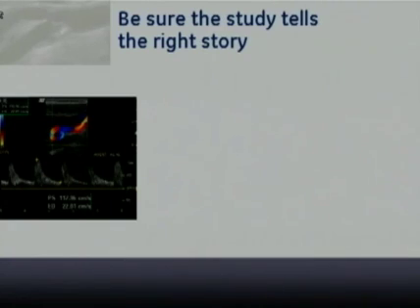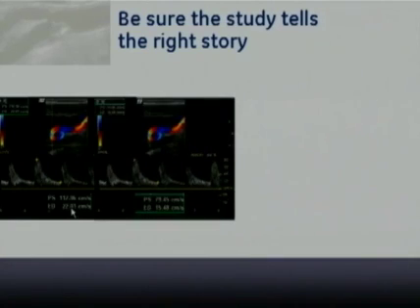In fact, in this case, proximal to the region of the coil, I had a velocity that was about 70 centimeters per second. And then as I moved into the coil, all of a sudden the velocity jumped up to 112. This didn't really make sense to me because there's no stenosis, no narrowing. Actually, it was just an angle correction error.